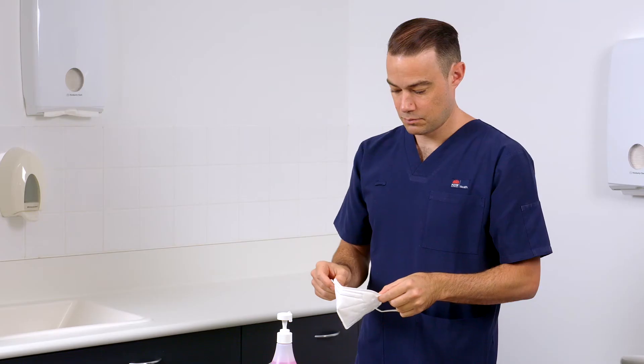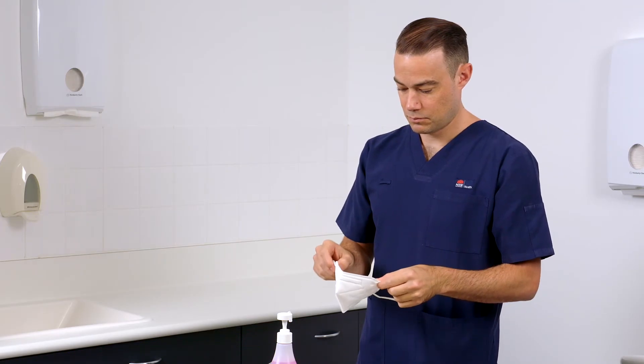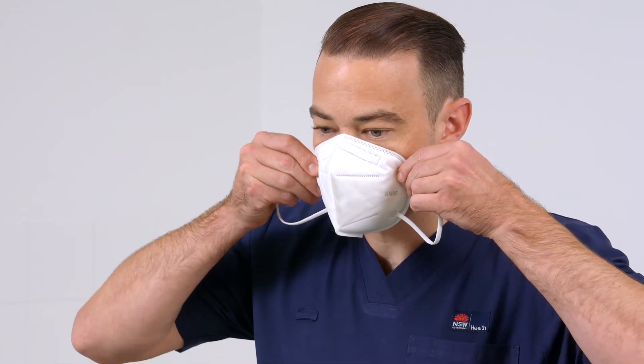Using both hands, hold the loops and place the respirator against your face covering your nose and chin. Position the loops behind your ears.